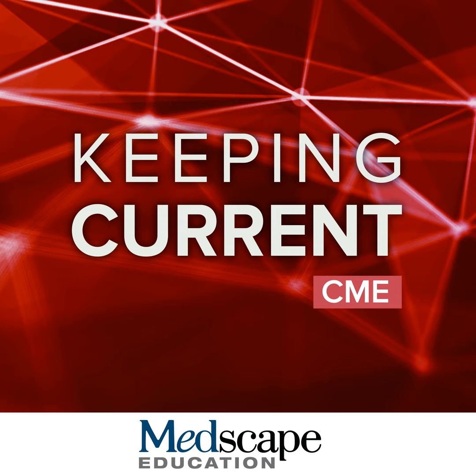In B, we can see some shadowing. We don't see exactly the whole right hepatic lobe, or the lateral part of the hepatic lobe. You feel like you can see most of the liver, but maybe some moderate limitations. This would be a visualization B. And on C, it's hard to see the liver. You have multiple areas of shadowing. You're not quite sure what's liver and what's not liver. That would be an example of visualization C.